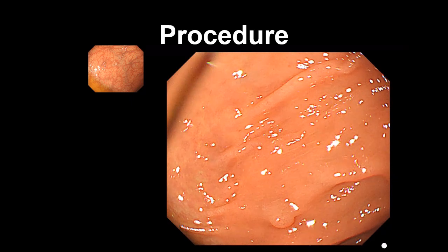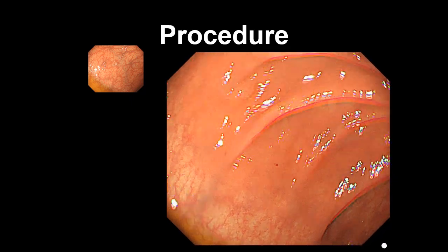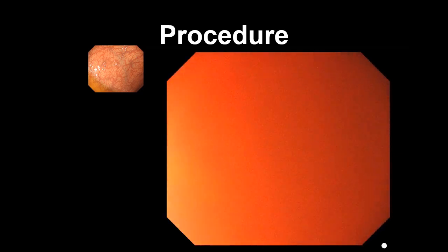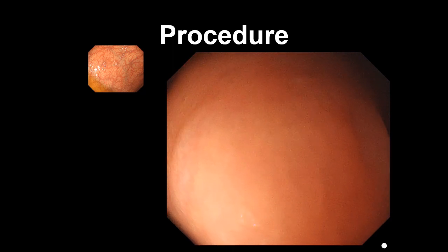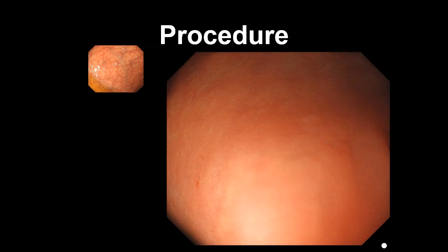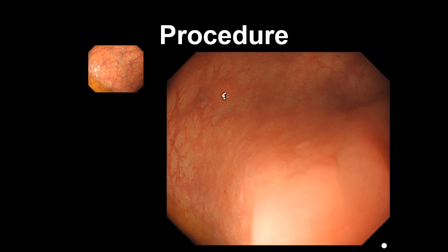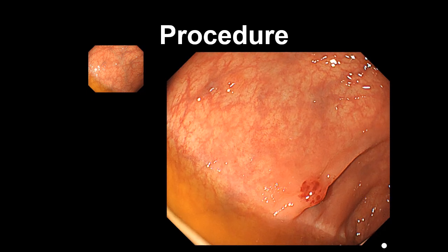Here is a demonstration of the suction marking method. As soon as a polyp is detected during the insertion phase, a suction mark is placed by aspirating colonic mucosa for at least 10 seconds. In this trial, one suction mark was created for each polyp at either the oral or distal side, collinear to the lesion. After confirming a clear suction mark, scope insertion was resumed.